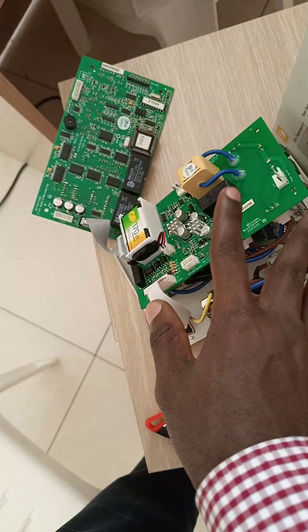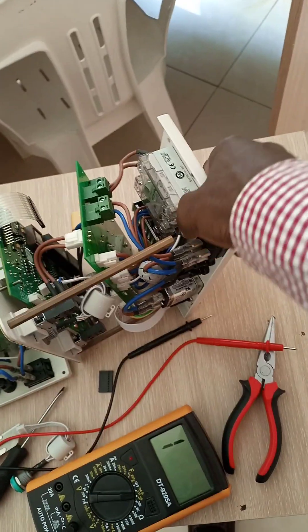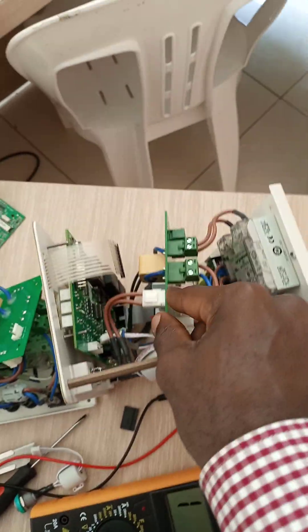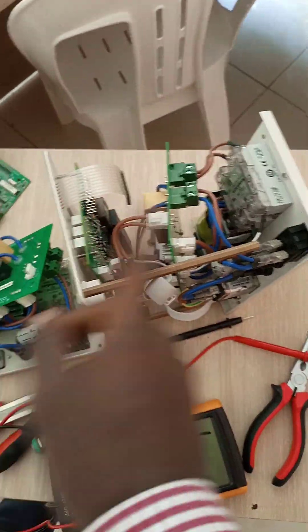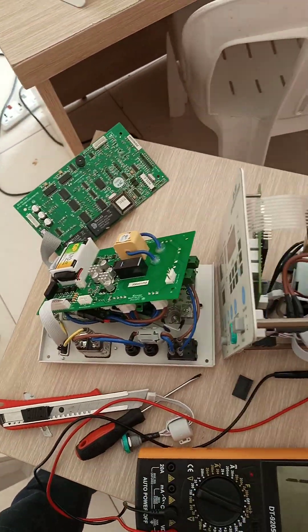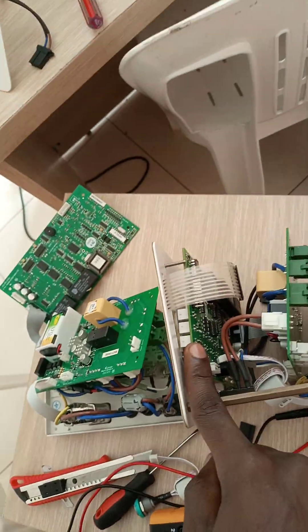This confirmed the power board had an issue. I then moved to the control board in the middle and swapped them the same way. The same result happened — the functional one worked while the non-functional one still didn't — which means the control board also wasn't the issue.